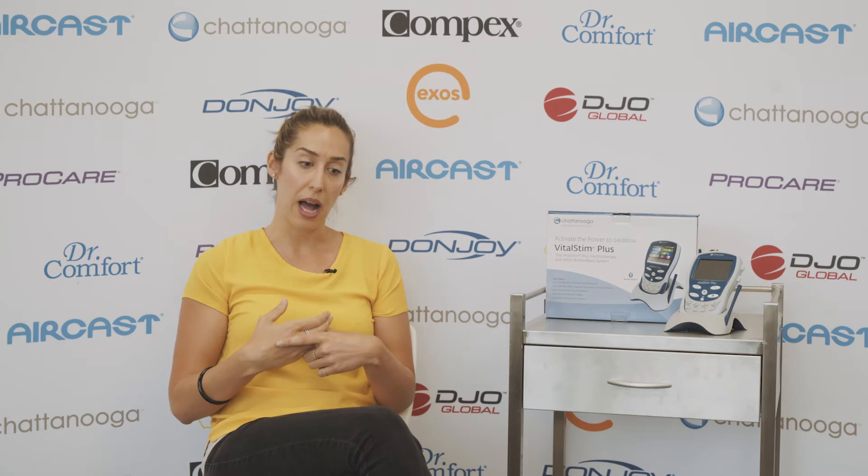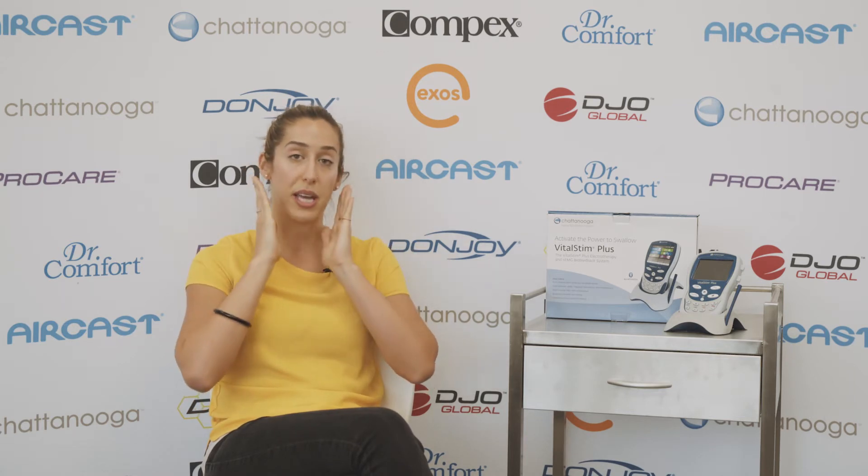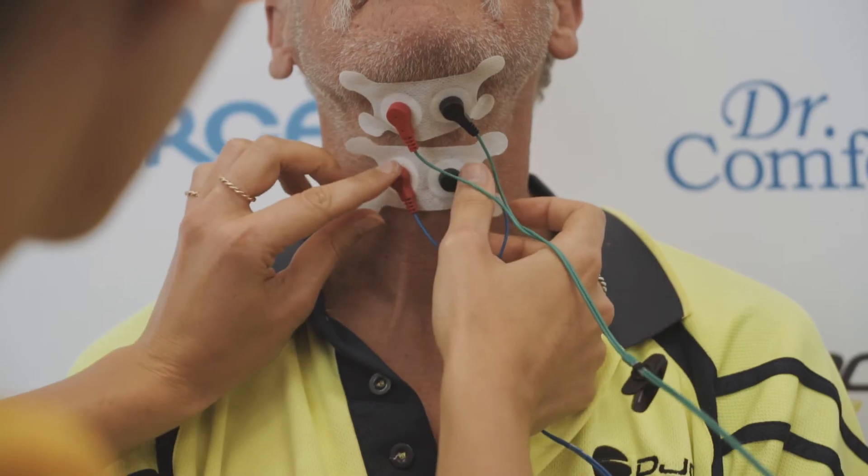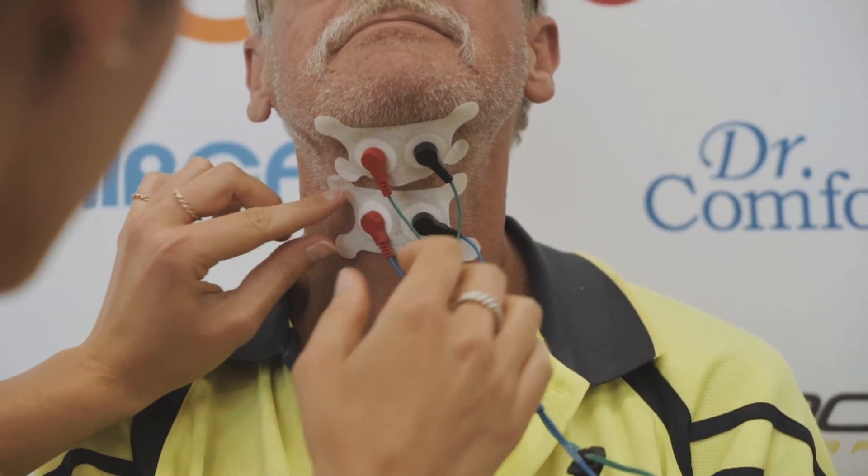The way neuromuscular electrical stimulation works is a patient comes into the clinic and we assess their swallowing and take a case history to determine the cause of the dysphagia, the swallowing difficulty. Once we determine that VitalStim Plus, the device, is suitable for them, we select the swallowing muscles — which could be on the face targeting the facial nerve, or anywhere on the neck or under the chin. We put electrodes on the muscles, do a number of different exercises, and also do some eating and drinking. The electrodes provide an electrical current to the swallowing muscles.